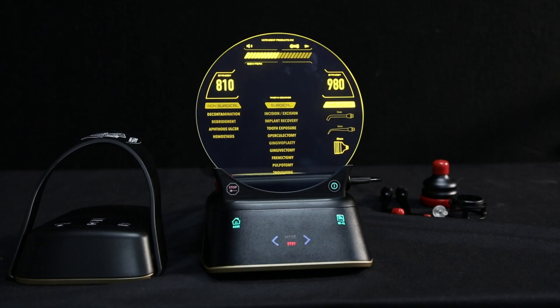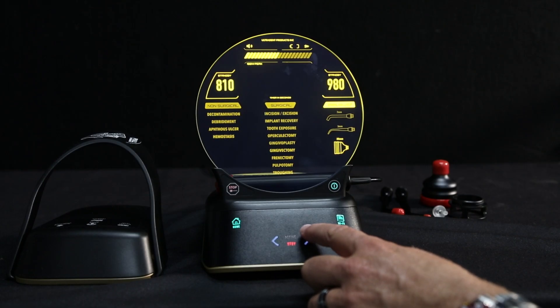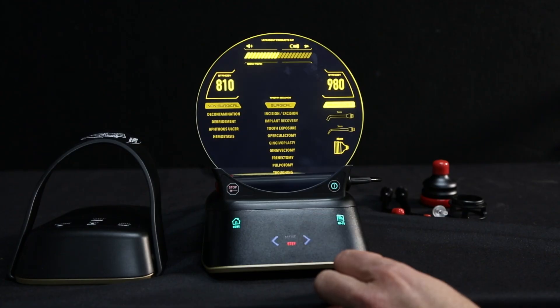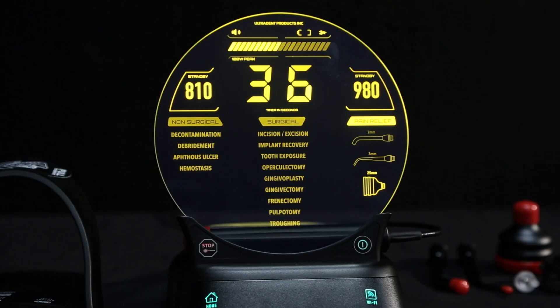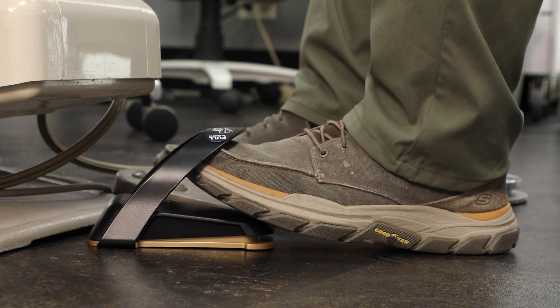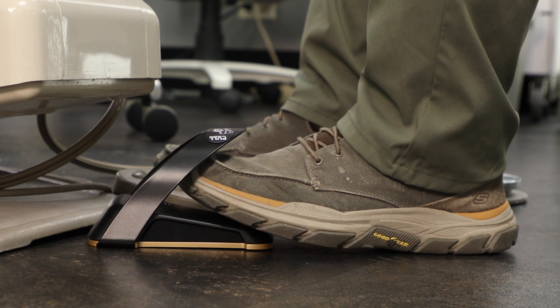The display will show time in seconds and can be adjusted with the right arrow by tapping for 1 second increments and holding for 10 second increments. The timer counts down in seconds and stops automatically after treatment time is completed. If the activation pedal is released mid-treatment, the timer will pause and will resume when the pedal is depressed again.